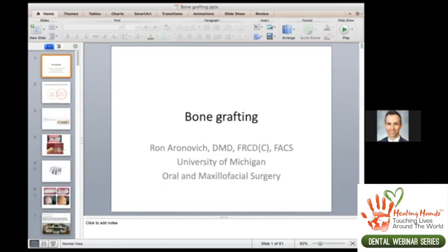But in many cases, I will do the bone graft first, and then if I see that there's a need for soft tissue grafting, like free gingival grafting, or to build up the soft tissue with connective tissue grafting, I'll typically do this after the bone graft, most commonly at the time that I expose the implant during the stage 2 surgery, or separately sometimes. So that's my typical approach there. And I always tell patients there's always a chance that we may need to do some soft tissue grafting.